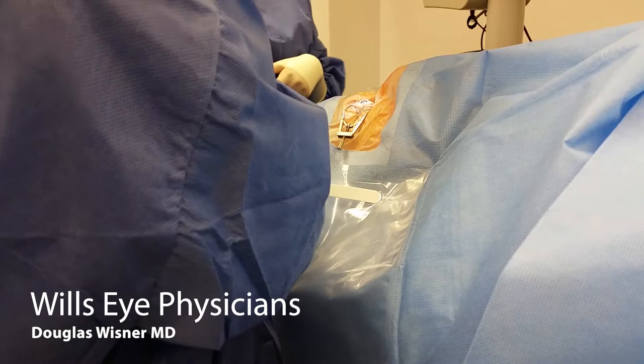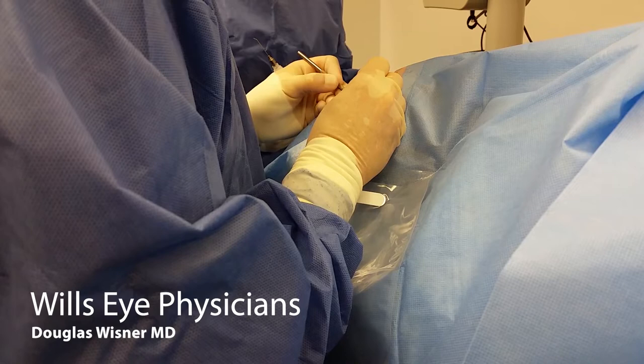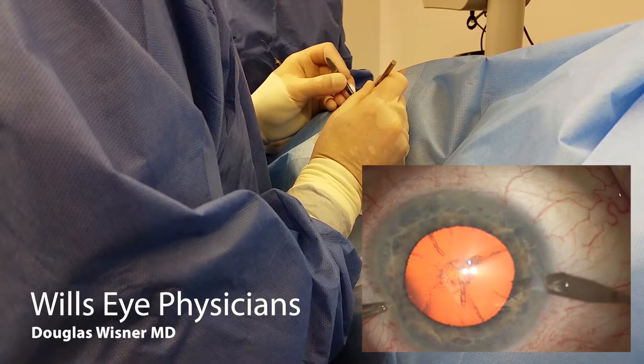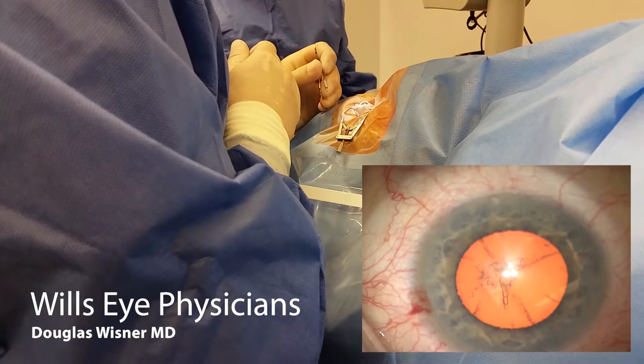Hi, this is Doug Wisner from Wills Eye. This is a recording of a cataract surgery quick chop technique using bimanual irrigation aspiration, paired with my hand positioning associated with the surgical video. I made my paracentesis. It should be noted that I'm left-handed, so I'm making my second paracentesis which is going to be approximately 80-90 degrees away from my main incision. I like to hold the paracentesis when making an incision because I feel it gives greater control of the globe.